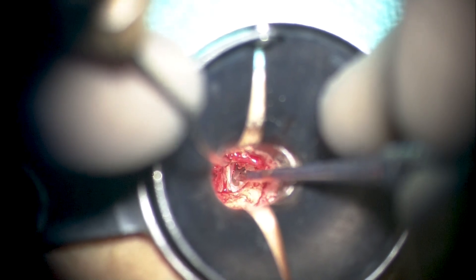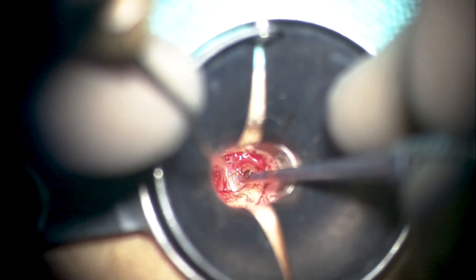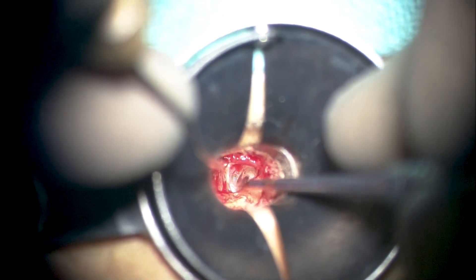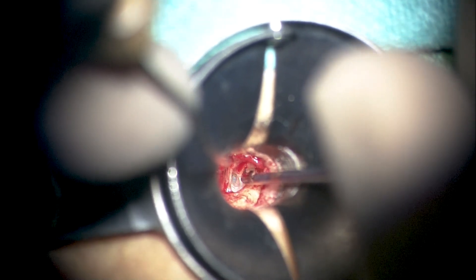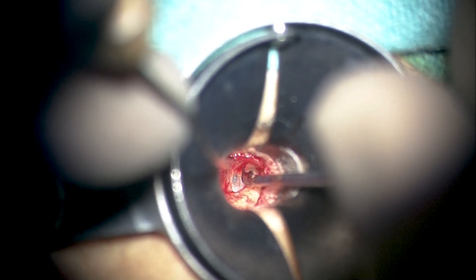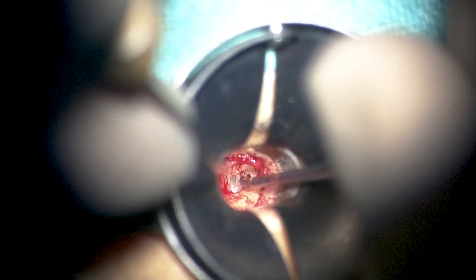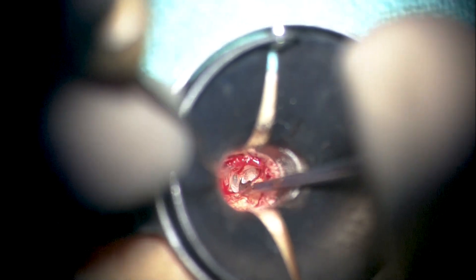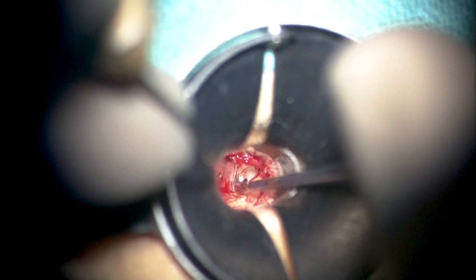Having the appropriate tools and instruments is very important. We need a very minimalistic suction, along with the ability to control the field in terms of bleeding, and to be very patient in elevating this epithelium from the lateral aspect of the incus. If this were to extend medial to the incus, we would definitely recommend removal of the incus as well. However, since this is on the lateral surface, we are making all attempts to gradually elevate the entire pocket from the incus long process.